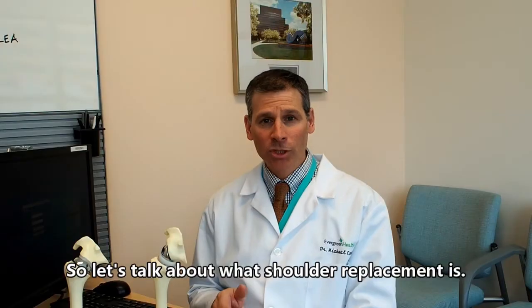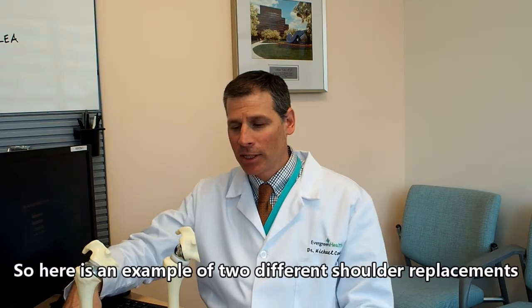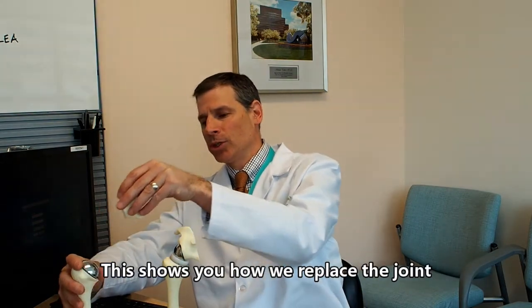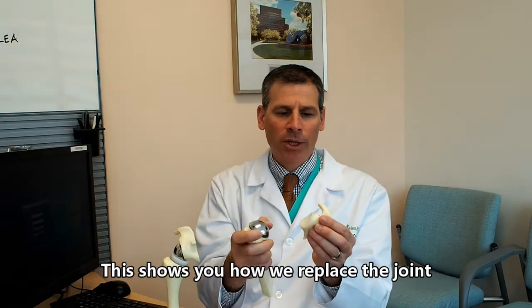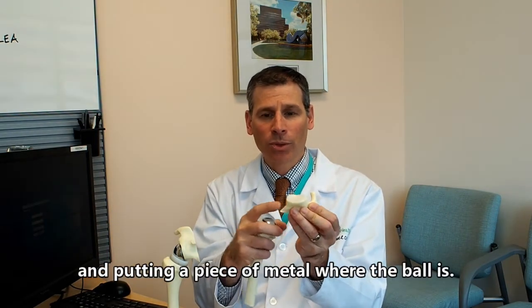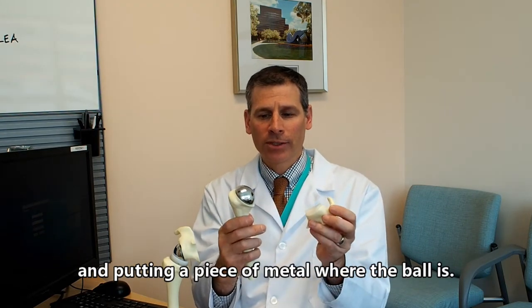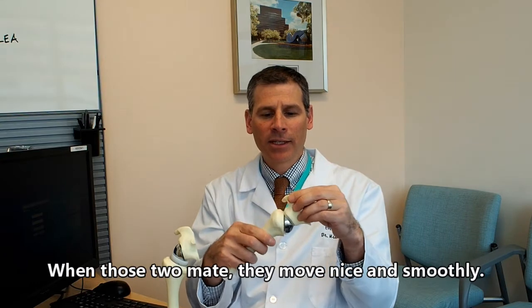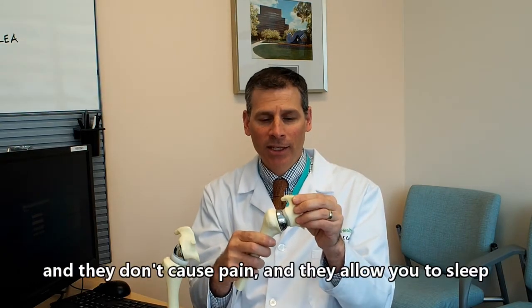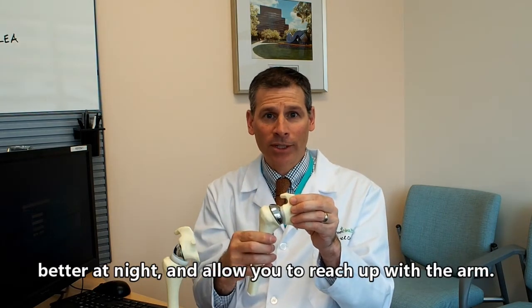Let's talk about what a shoulder replacement is. Here is an example of two different shoulder replacements. This shows you how we replace the joint by putting a piece of plastic on the cup of the shoulder and putting a piece of metal where the ball is. When those two mate, they move nice and smooth — they don't cause pain, they allow you to sleep better at night, and allow you to reach up with that arm.